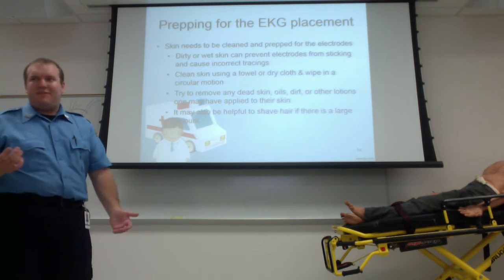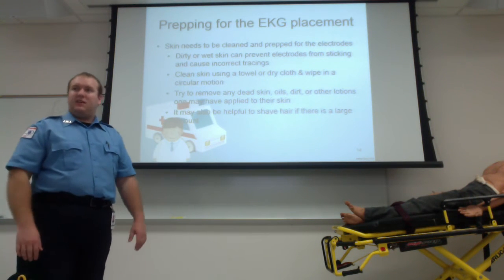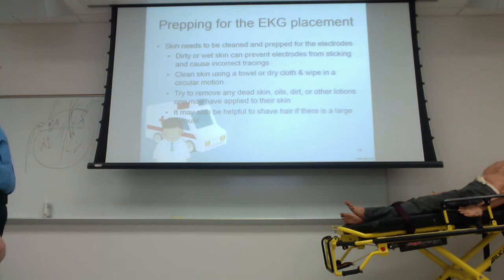You may get laughed at by a few medics who come up and see you wiping the skin before you put on electrodes. Just tell them they need to go back to school and learn how to do the job. Don't really do that. Just say, okay, thank you.